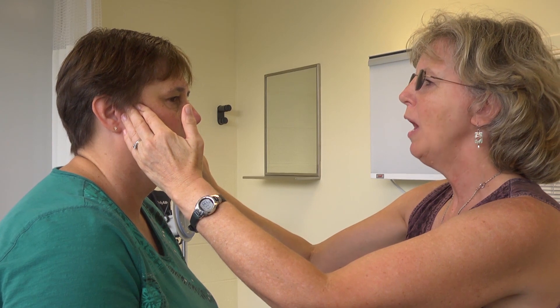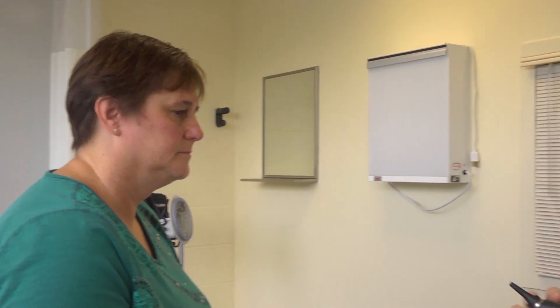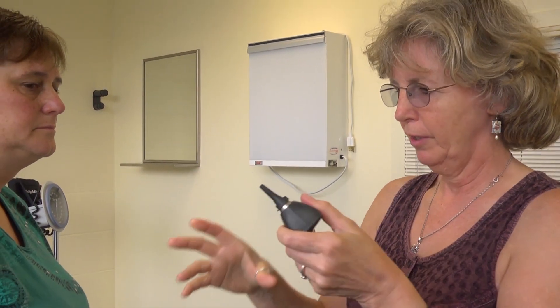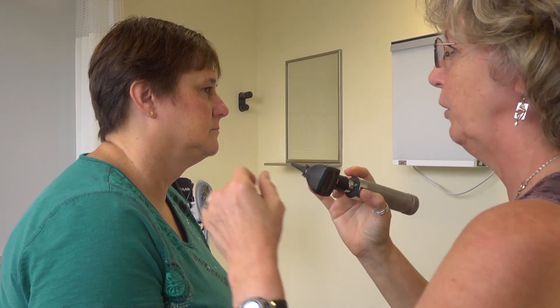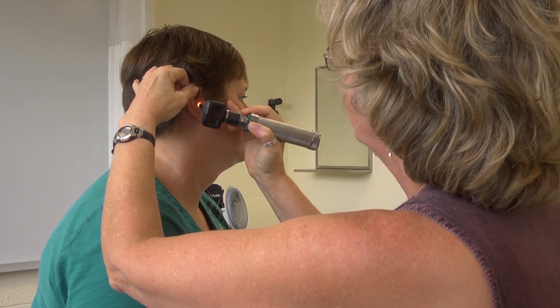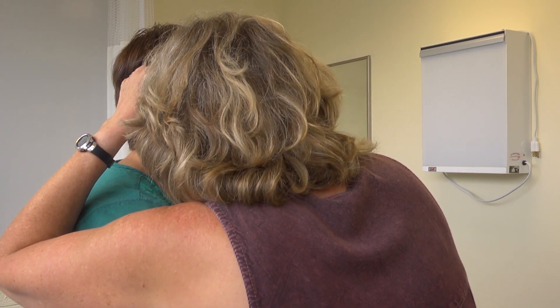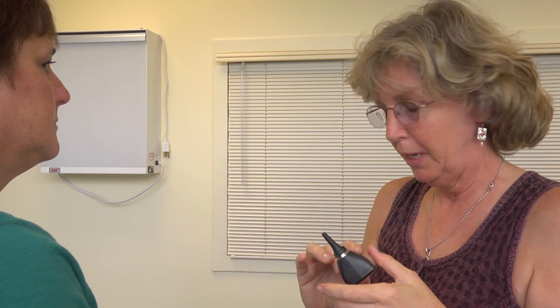I'd like you to open your jaw wide and then shut it again. For the otoscopic exam, it's good to get used to holding the otoscope like a pencil so you can stabilize against the head in case the patient moves. For an adult, to get the canal straightened out, you pull up and back, then insert the otoscope while observing. The ear canal appears clear with no cerumen. The tympanic membrane is pink without bulging or retractions.